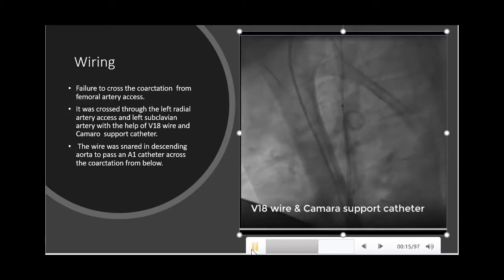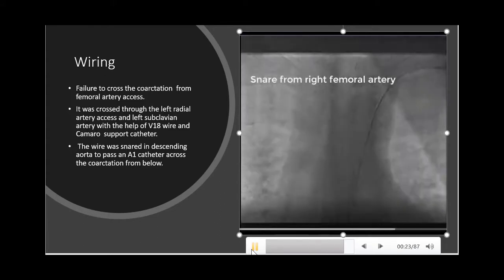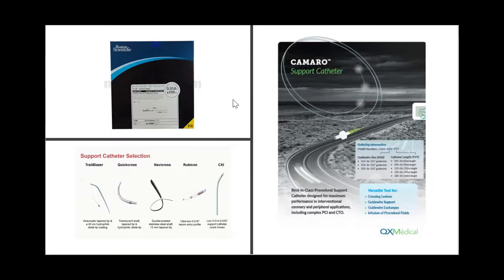After that, the V18 wire was snared from the descending aorta to the right femoral artery. In this case, we used the V18 guide wire to pass the lesion, which is an 0.018 peripheral guide wire. There are many different support catheters available when applying 0.035 or 0.018 guide wires. We applied a coronary support catheter in this case.